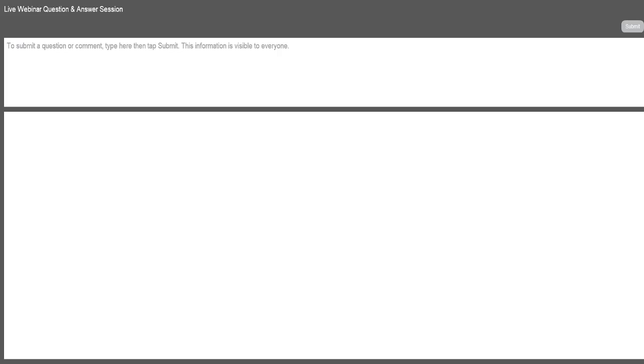So it's using the actual prophy paste. Yes, you do not want to use prophy paste around an implant, especially a coarse prophy paste if the patient has stain. If there are any exposed threads, it's not good. It's not good for the implant surface. You want to use something that's not going to scratch it.